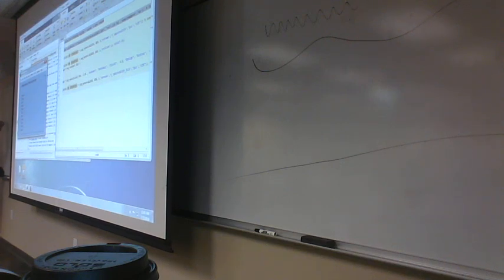So, when you have data, we're always talking about sine waves, right? You guys follow? We sample, and we measure that. By sample, we mean how often do we measure it? Do we measure it every now and then? What would it look like if we measured that data at that frequency, where those dots are? It would look like those dots.